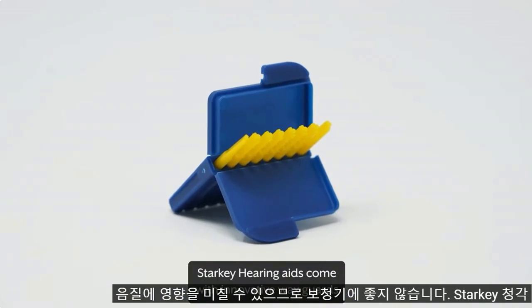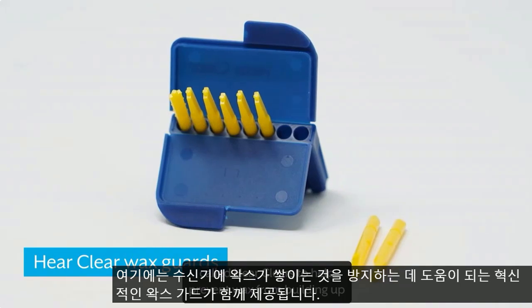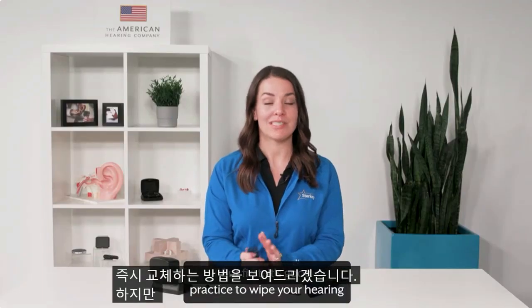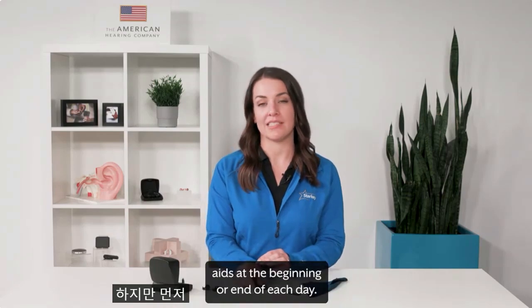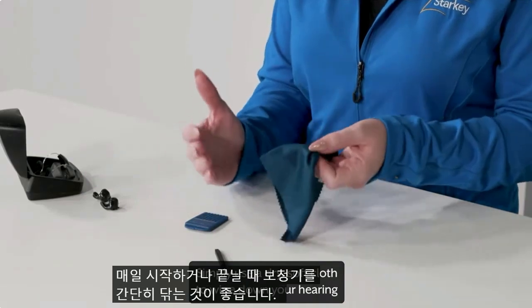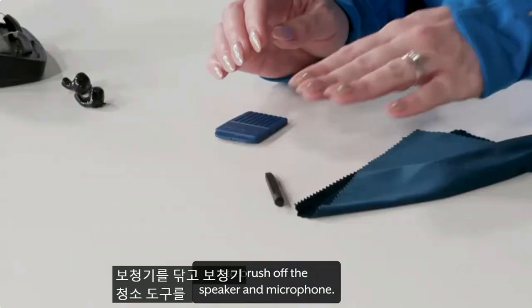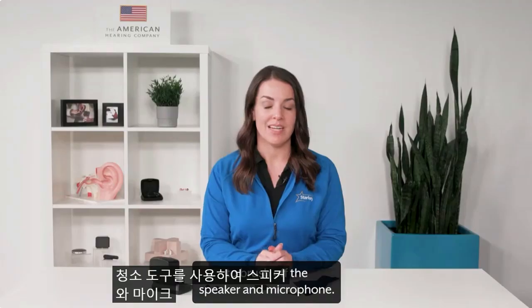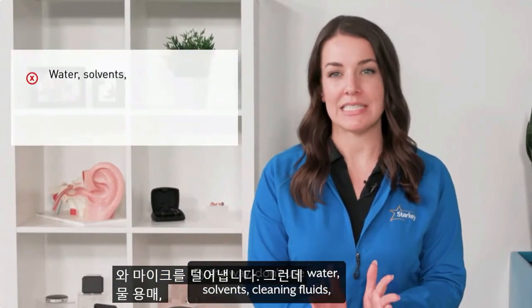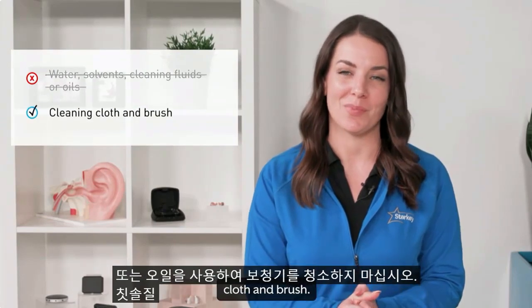Starkey hearing aids come with innovative wax guards called Hear Clears to help prevent wax from building up in the receiver. I'll show you how to replace those in a second, but first, it's good practice to wipe your hearing aids at the beginning or end of each day. Simply use a dry, soft cloth to wipe down your hearing aids and your hearing aid cleaning tool to brush off the speaker and microphone. It's that easy. By the way, don't use water, solvents, cleaning fluids, or oils to clean your hearing aids. Just the cleaning cloth and brush.